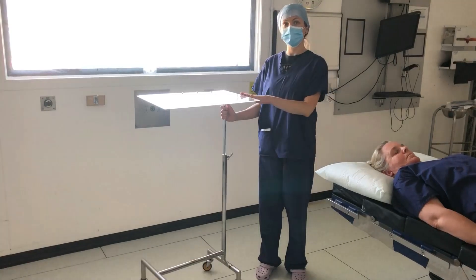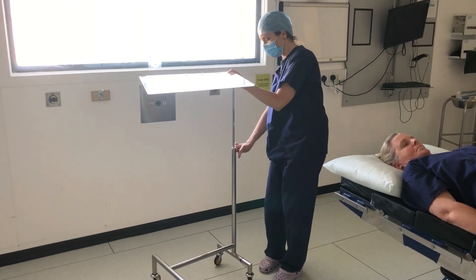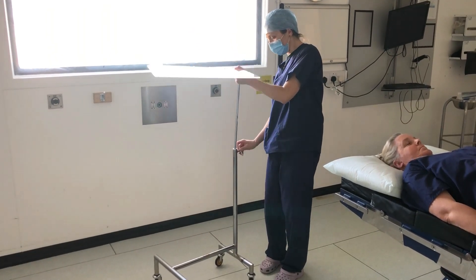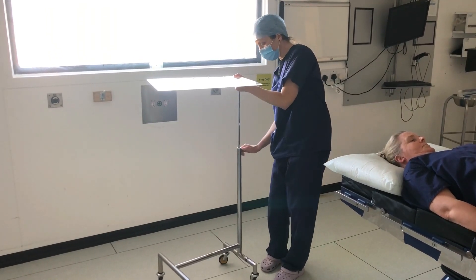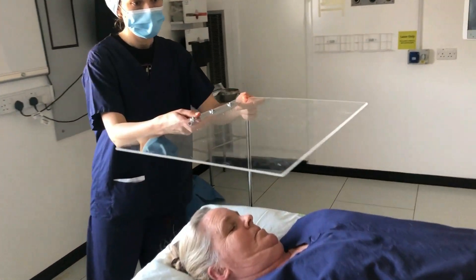Here is the table mounted using the previously mentioned Mayo table base. As you can see, not only the height but also the orientation of the table can be easily adapted, which makes it suitable for a variety of EMT procedures.